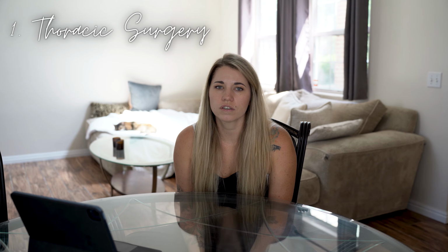Patients undergoing thoracic surgery require positive pressure ventilation. As I stated earlier, a natural patient-derived breath is started with a subatmospheric pressure in the thoracic cavity, but something that's causing any kind of disruption to the thoracic cavity, be it an incision or trauma to the thoracic cavity, can allow the area around the lungs to equalize with normal atmospheric pressure, thus inhibiting the patient from being able to use the subatmospheric pressure to pull air into their lungs. So in particular, patients that are undergoing thoracic surgery who have their chests open are not going to be able to draw air into their lungs, and they're going to require positive pressure ventilation.